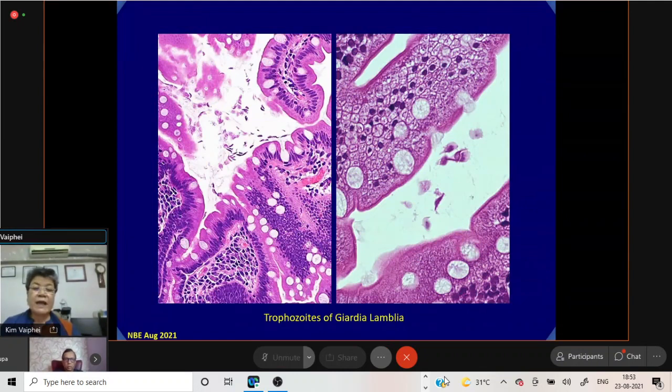And now one thing which one has to look for in the duodenal biopsy is the parasite. This is one thing which you should all the time expect. Maybe the patient is symptomatic, maybe asymptomatic, but the presence or absence has to be all the time commented upon. And here, some of them are sickle shaped, and here this is a face-on, which is racket shaped. One could see the 2 eyes, the nose, and I think that's as much as one can see in light microscopy.